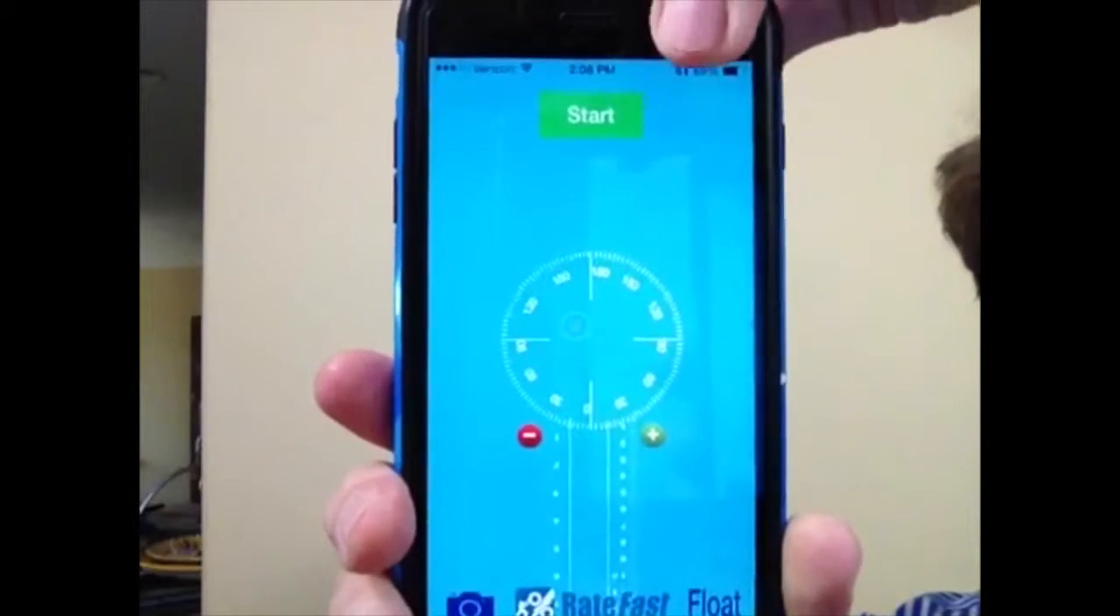To begin the measurement process, simply tap the button on the top, start, and the Goniometer is now in measurement mode.